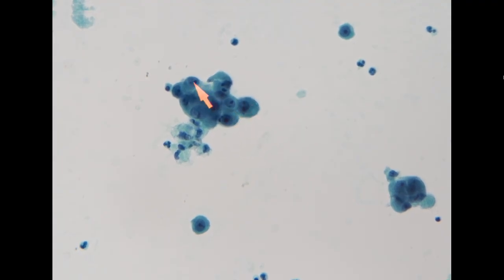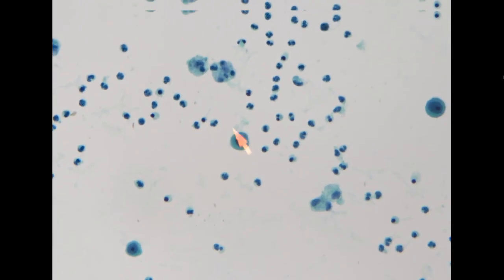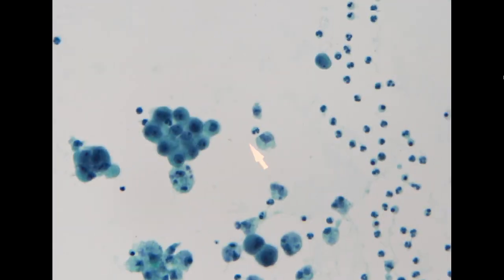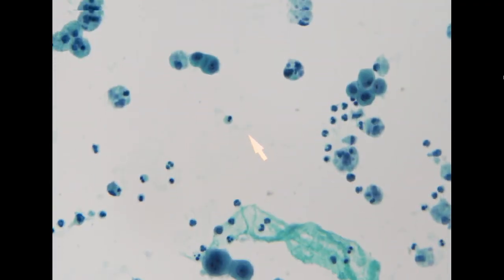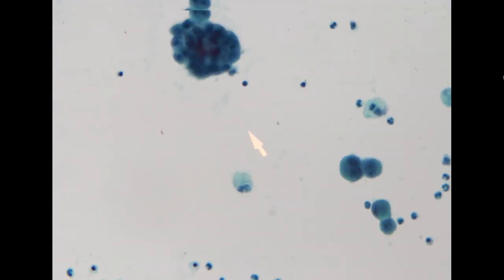Additionally, when we see these individual cells and compare them to the adjacent normal mesothelial cells, they don't seem to have a very big difference based on cytomorphology. So this looks a little bit strange.